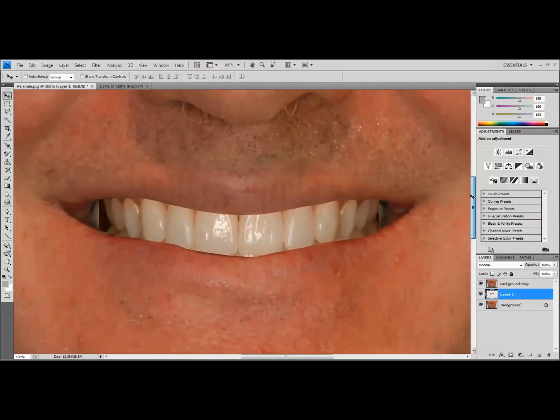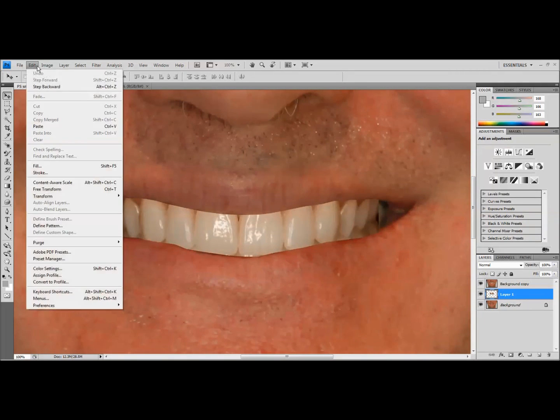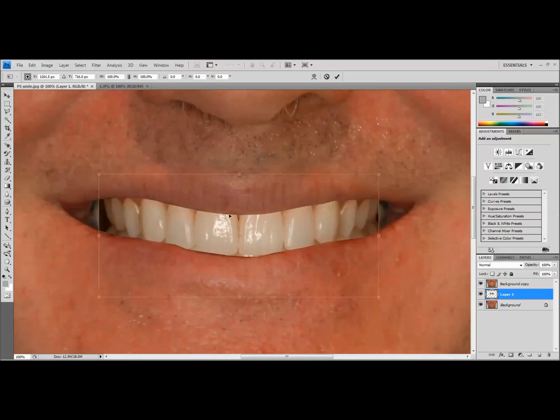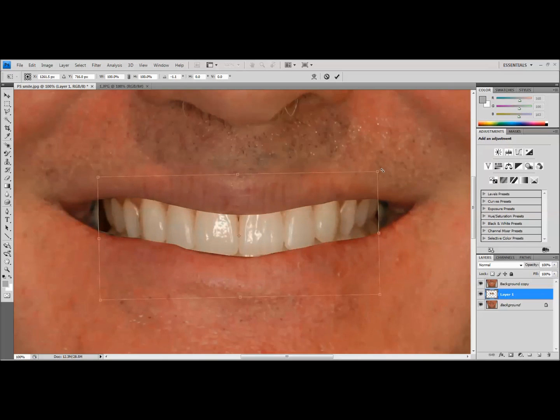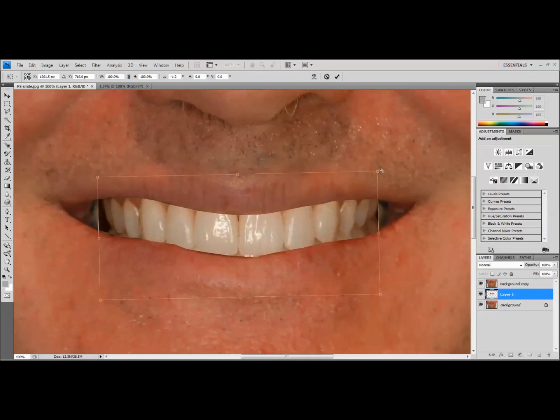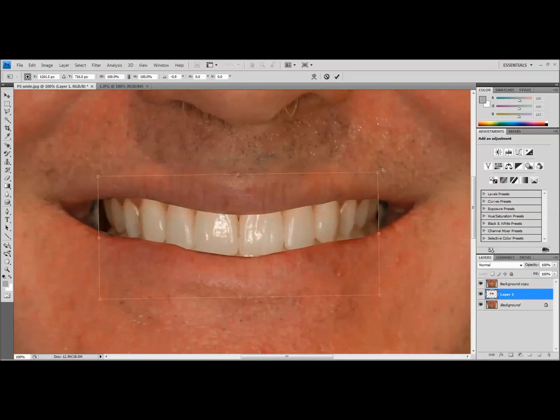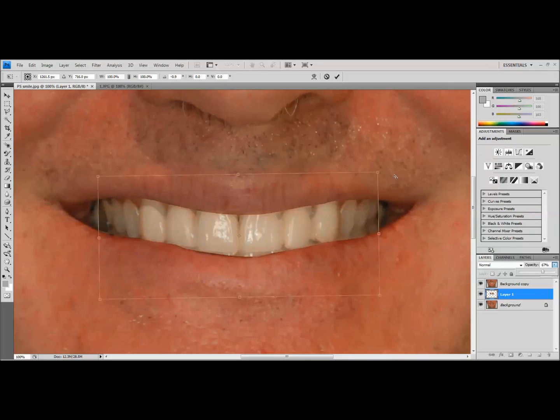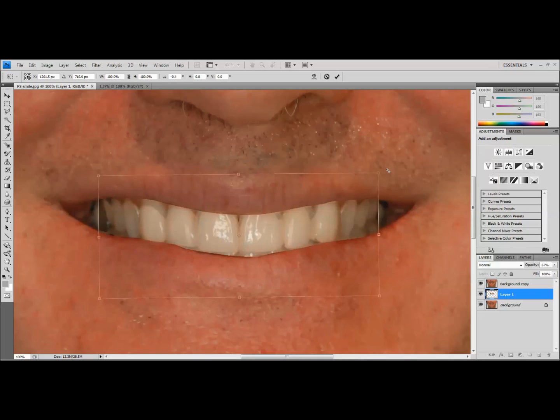We'll get this centered in the mouth. Now, one other thing that I'm noticing is that it might be a little bit canted. And so again, I'm going to highlight the layer that we're working on, free transform. And it looks to me like this needs to get rotated a little bit. So if you just grab up here around the corner and get this curved arrows, you can rotate this however you need to do it. If it's helpful, again, come back and turn your opacity down so that you can get things lined up a little bit better. So that looks good there.